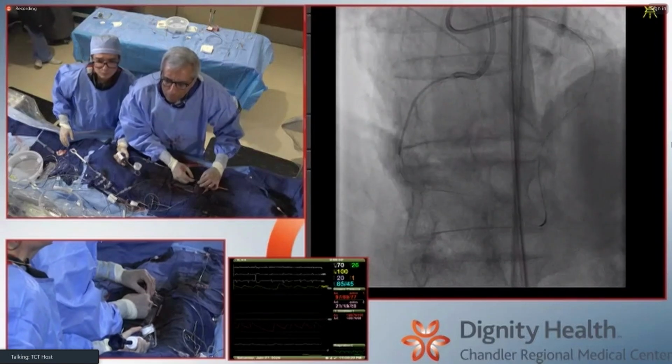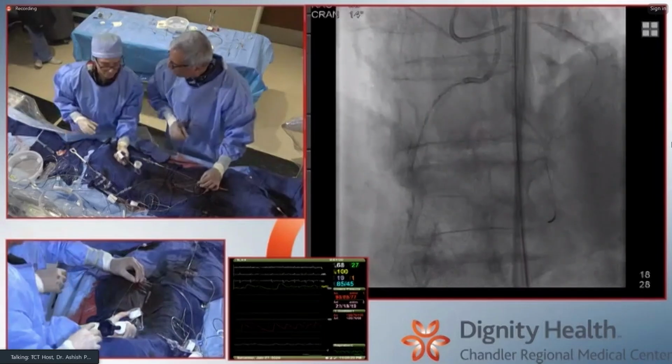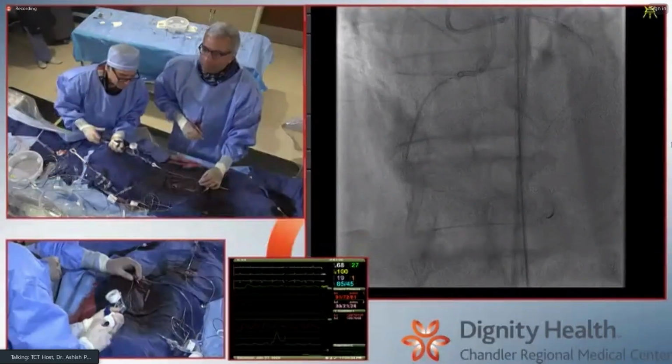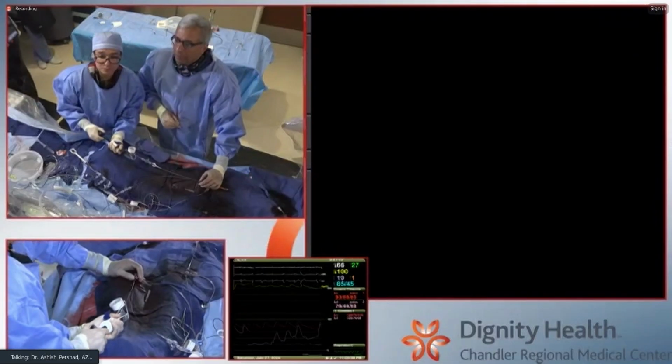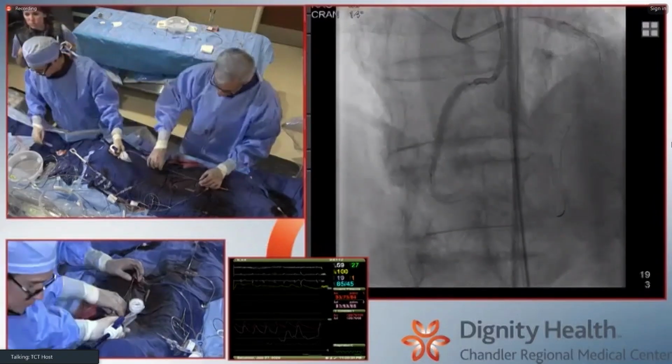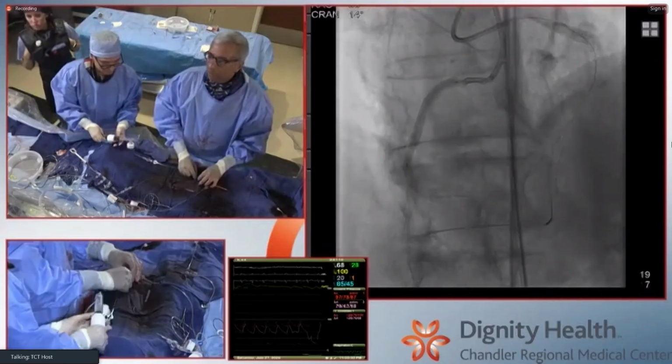You can prevent by the IVL. The problem is I don't think you're actually going to modify the segment of vessel that you've gone around with IVL at this point. Maybe later when there's a new intima and there's more structure on the other side, you can actually get that impulse conducted, but at this point you're just going to stretch one side of the vessel and the impulses are going to go out that side, right?